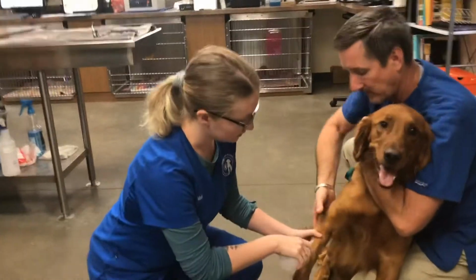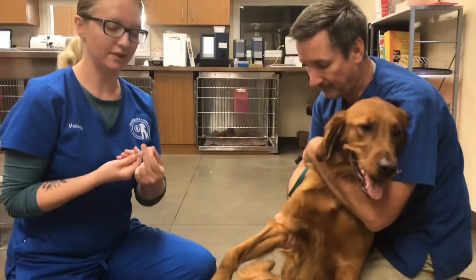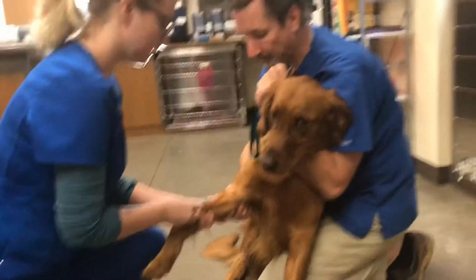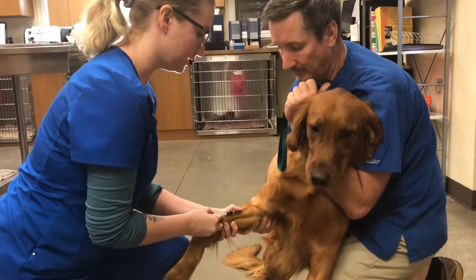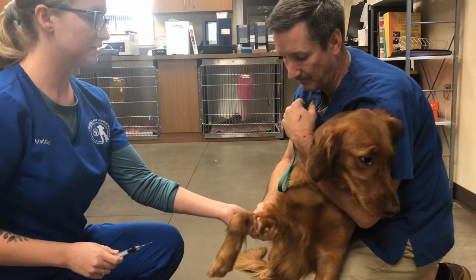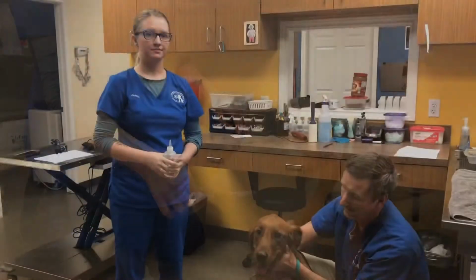The first thing I'll do is wet the area with some alcohol. This will sterilize my area, but will also help me visualize the vein through all of his hair. I'm going to insert the needle, pull back on the plunger, and then when I'm done, I'll let my restrainer know so that he can apply pressure where I drew the blood so that he doesn't develop a hematoma. And there's our blood sample.